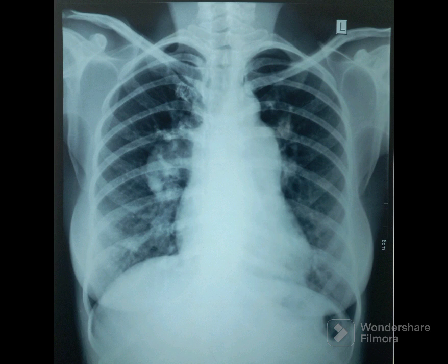Other parameters that can be noted include the widening of the hilum — that is, the distance between the most lateral visible border of the hilum to the other lateral border — and an increase in the hilum-to-chest ratio. In summary, this chest X-ray shows pulmonary hypertension with right ventricular hypertrophy.